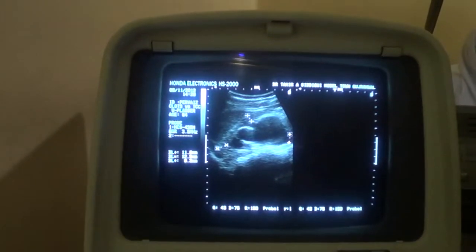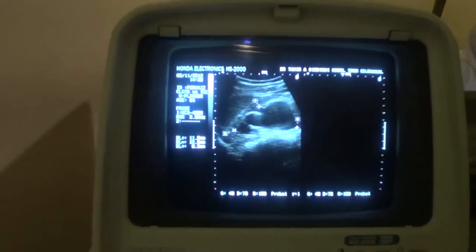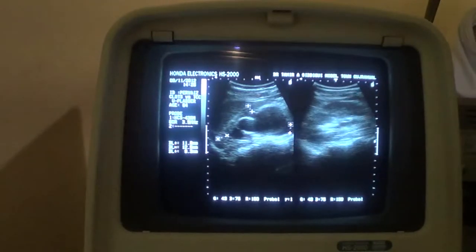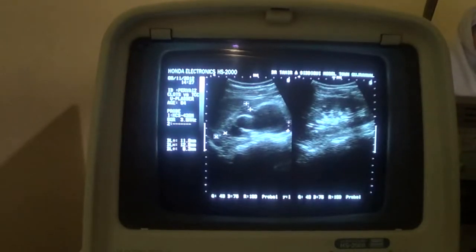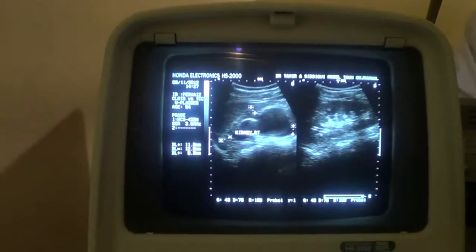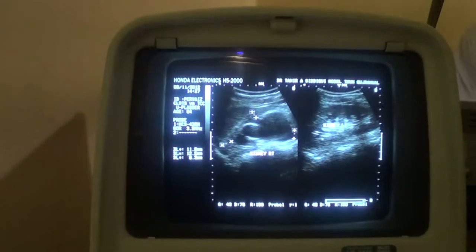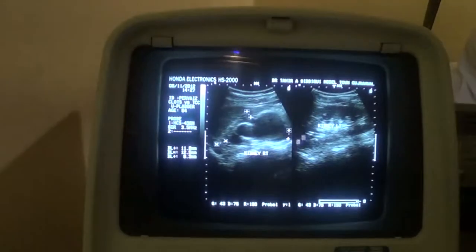So this was the right kidney. Definitely the ureterovesical junctions are involved due to that laid out thick material, giving more pressure on the right side than on the left side. As you can see, the left kidney is normal. This is the right kidney, this one, with moderate to massive hydronephrosis, with thinning out of the parenchyma, with muffled corticomedullary distinction.